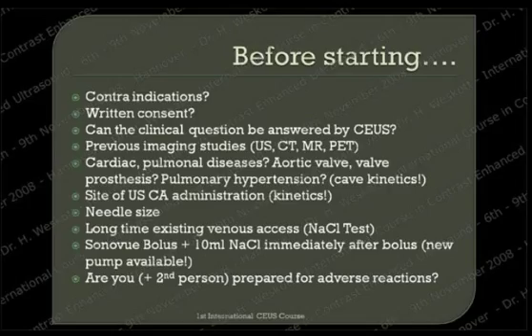SonoVue bolus plus 10 ml saline immediately after the bolus. This is, of course, a standard procedure. Sometimes for very special questions, you can also perform an infusion of contrast agent. We now have, and it just arrived, a pump where two syringes are mounted.